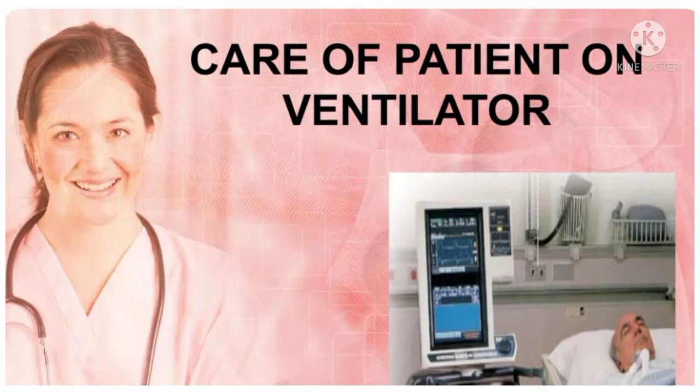Role of nursing personnel. The registered nurse (RN) develops a plan for communication with the patient who has a tracheostomy or an endotracheal tube. Give sedatives, analgesics, and paralytic drugs as needed. Teach the patient and caregiver about mechanical ventilation and related procedures. Auscultate breath sounds and respiratory effort, assessing for decreased ventilation and adventitious sounds. Monitor ventilator settings and alarms. Determine need for endotracheal tube suctioning and suction patients as needed. Reposition and secure the endotracheal tube based on agency policy. Monitor oxygenation level and signs of respiratory fatigue during the weaning procedure.